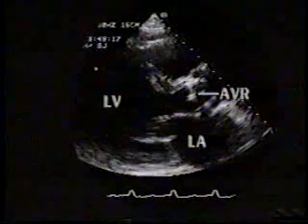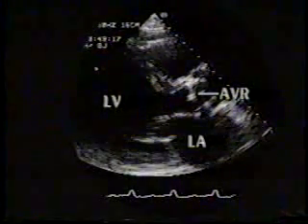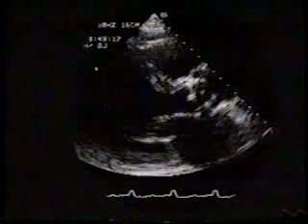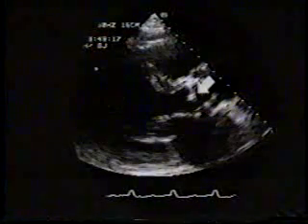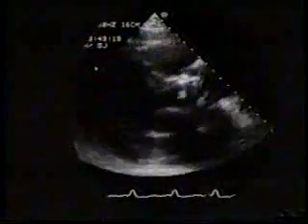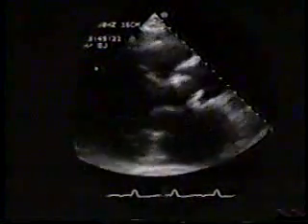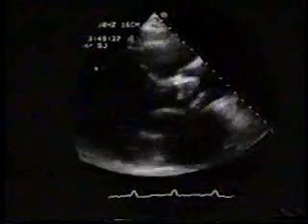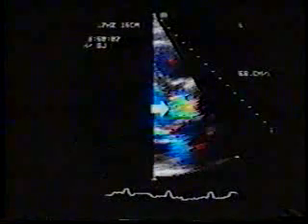This patient had a mitral annuloplasty and implantation of a heterograft aortic prosthesis. These are the stents. The valve had degenerated. This cusp is torn, and it is prolapsing into the left ventricular outflow tract. In systole, mitral regurgitation fills the left atrium, and a broad jet of aortic regurgitation fills the LVOT in diastole.